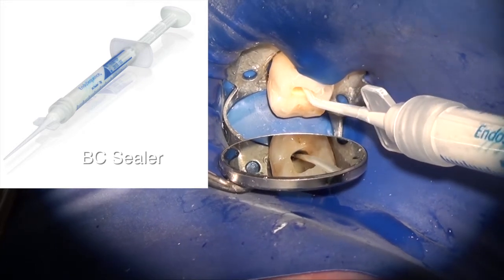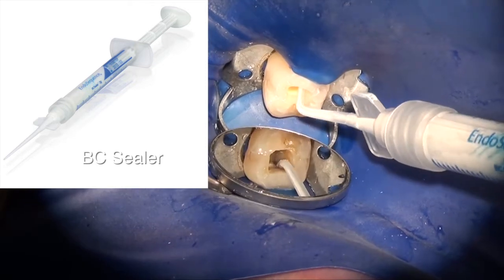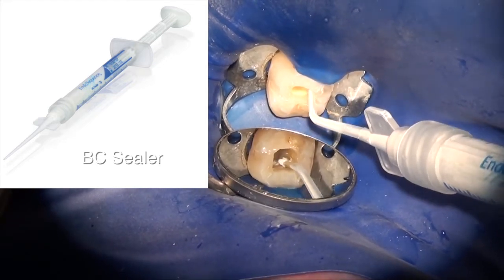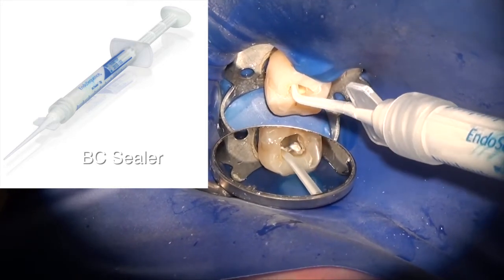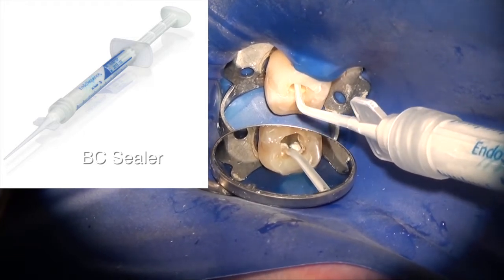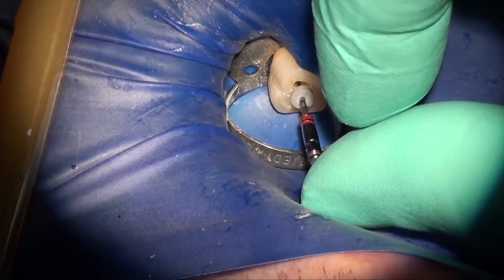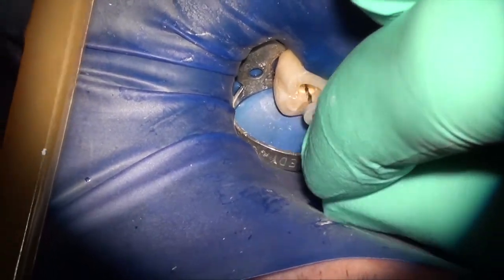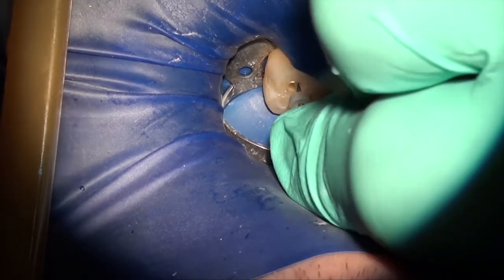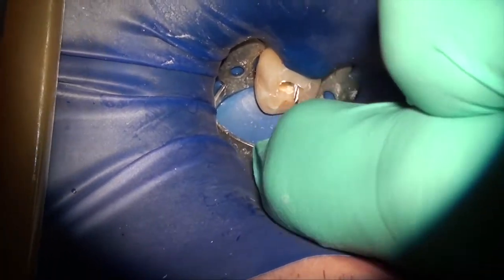And now I am placing the BC sealer in each canal, and as usual, based on the protocol that I've developed since 6 years ago, this is the advanced obturation style, so I'm directly injecting only up into the upper half of the canal, and then I'm using the finishing file. This is to just push the sealer down to the apex. This is the safest way of doing it.